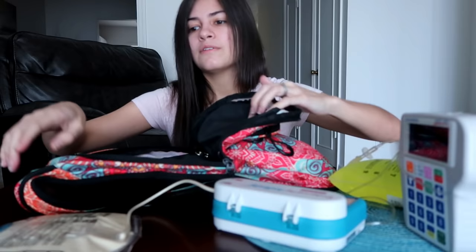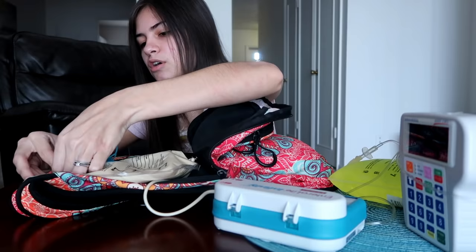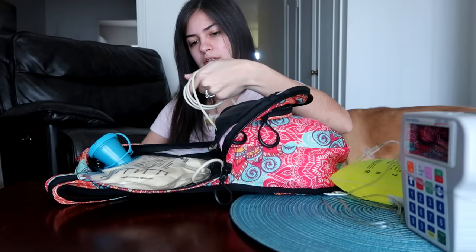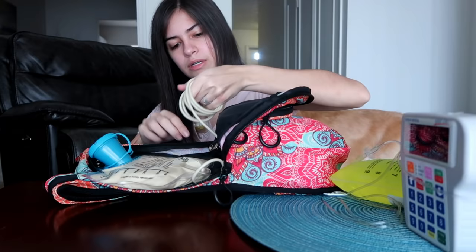Feeding tube backpack. I clip in the feeds to the top clip here. Pump goes in the bottom of the bag, and then I coil the excess tubing because I don't want it hanging out to risk getting caught on anything or getting yanked. So I just coil this up. I leave about that much. I clip in the excess tubing. I have a clip on the side here too.